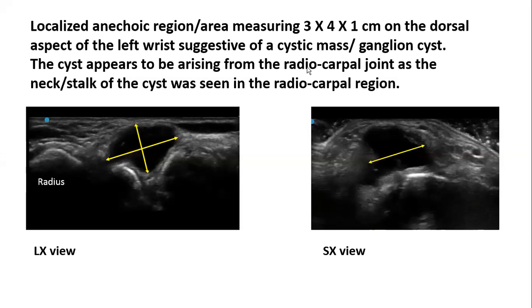Nothing is absolute in ultrasound, so there will be some exceptions, but just know that everything is grayscale. We cannot assign a specific scale, anechoic or hypoechoic, to a tissue, because it's based on physics how much a tissue is reflecting the echo back, and that can change whether the structure is normal or abnormal. Make sense?